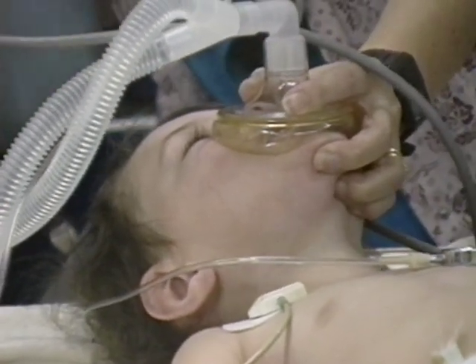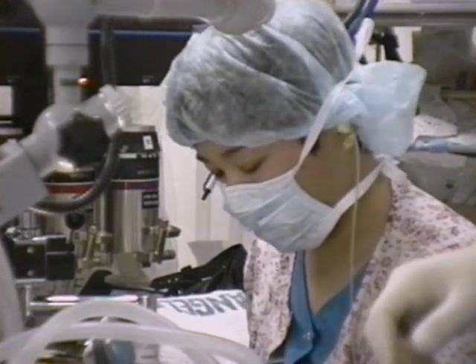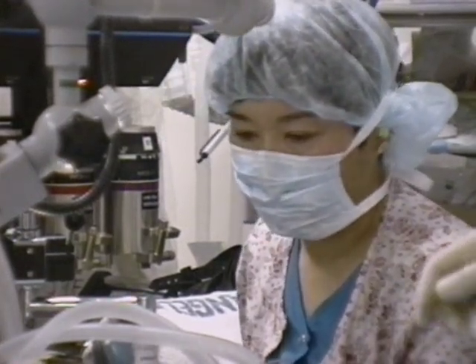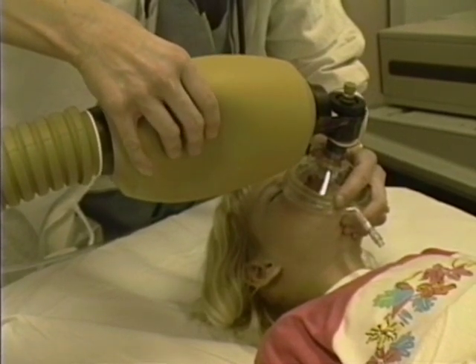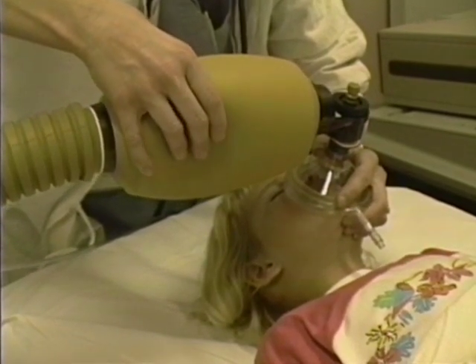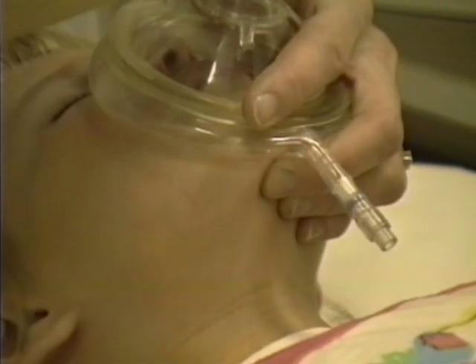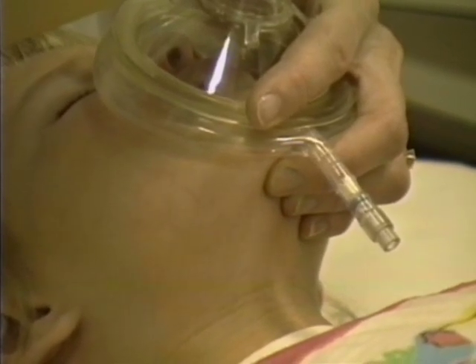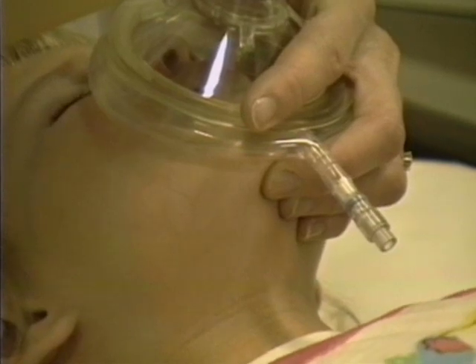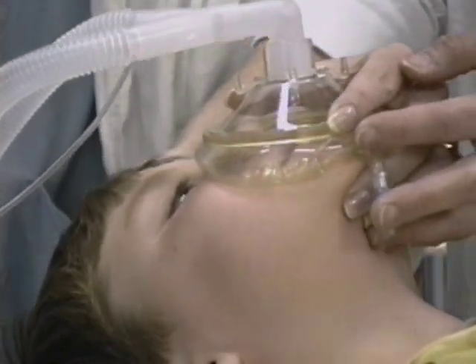If you have a good mask seal, little or no air will escape around the mask. You can tolerate some leak as long as you can ventilate the patient. If you don't have a good seal, then you must get a better fit. Typically, the leak will be on the side with the bag opposite the hand holding the mask. To improve fit, rotate the ventilation bag attachment to change the point of maximum pressure. Reposition your hands. If you have an assistant, ask her to push the cheek up against the outside of the mask at the leak sites.